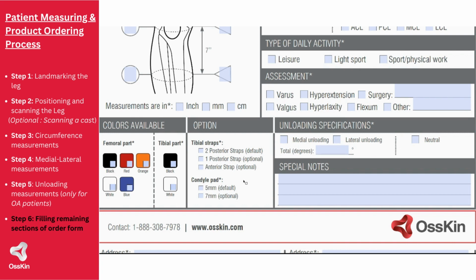In the options, the standard or default is 2 posterior straps. You also have the option of having 1 posterior strap, which can be used with very, very short patients. The anterior strap is optional. We suggest you use the anterior strap for patients that have a high BMI with a lot of soft tissue, or if patients have ligament instability.